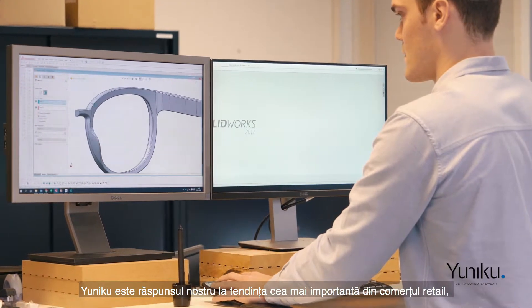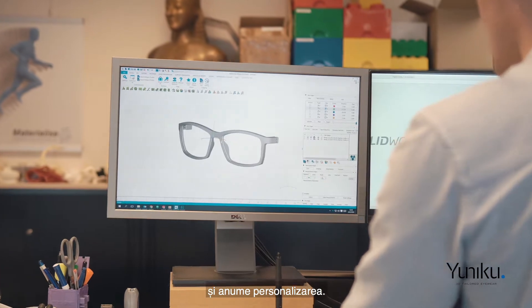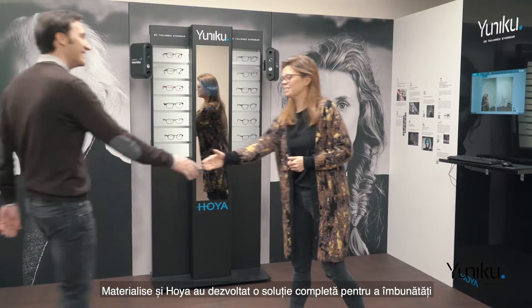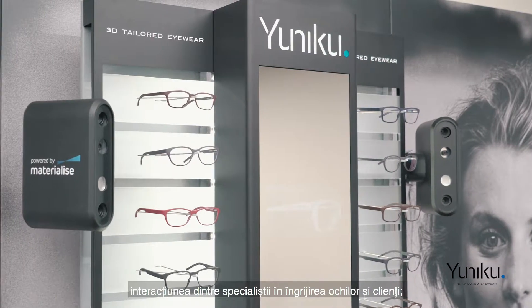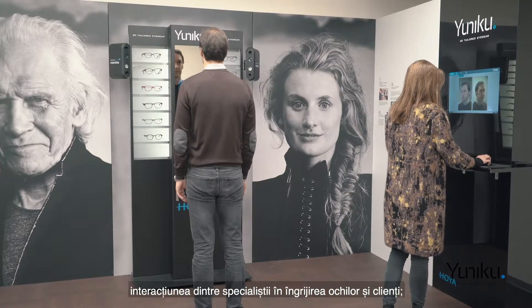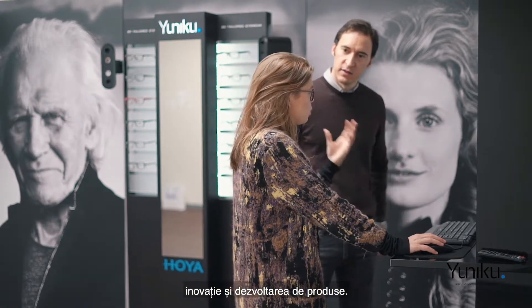UNIQ is our answer to the most important trend in retail, which is personalization. Materialise and Hoya have been developing an end-to-end solution to enhance interaction mechanisms between customers and eye care professionals that enables novel experiences and innovation in product development.